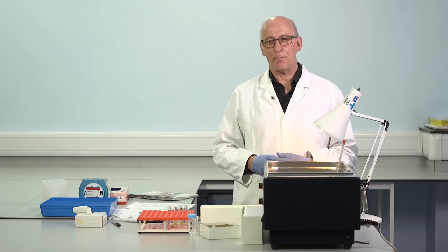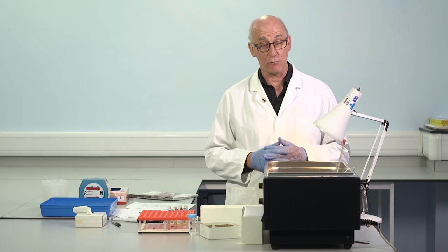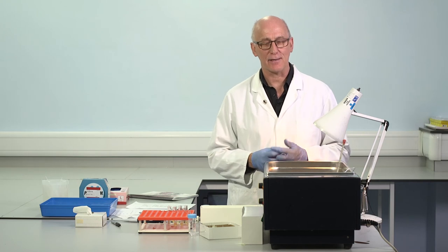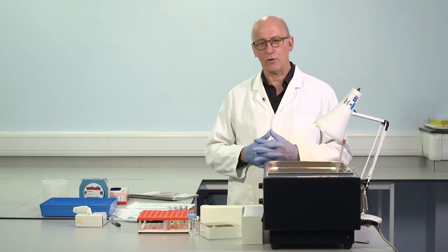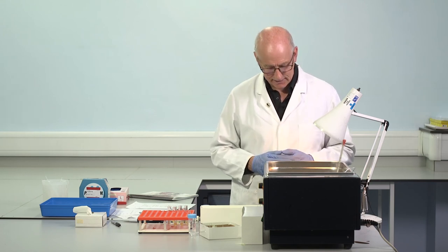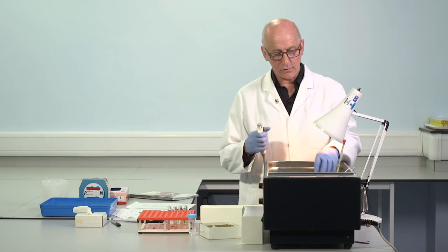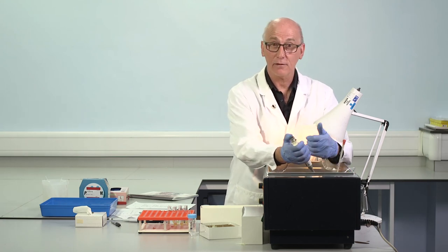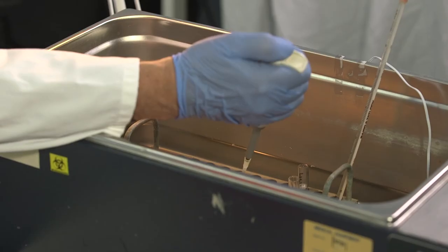Any problems in collecting the sample, difficult venipuncture, any delays in blood collected into a syringe prior to mixing with anticoagulant, can lead to changes in the sample which impact on APTT more than any of the other tests. We can start to get clotting activation in the sample, which generates enzymes, and when we make the APTT, sometimes we're seeing extremely short times because we've got enzymes present. Sometimes we're seeing consumption of clotting factors, and by the time we're making the test, the sample's partially clotted, we've lost some of the clotting factors, and we can see artificial prolongation.